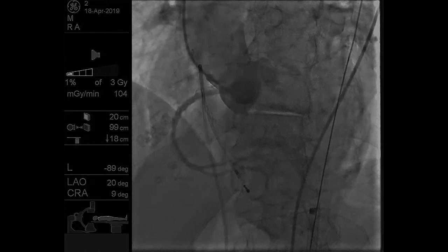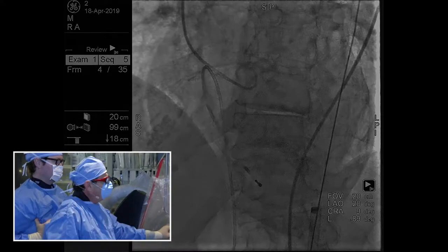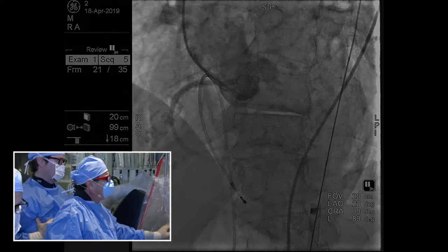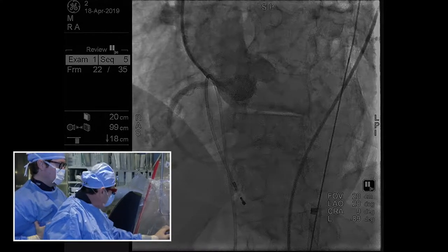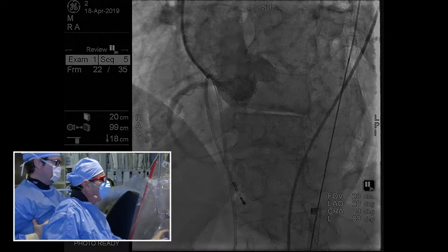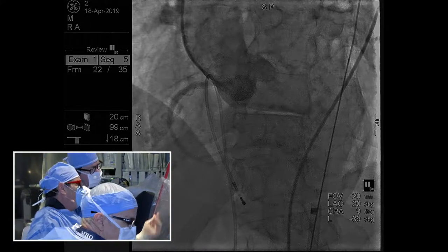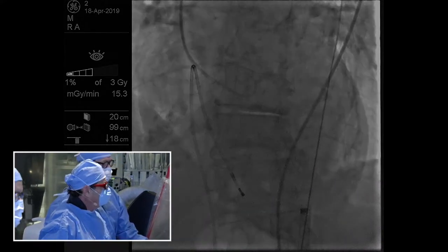Okay. And now we've got a nice cusp view. Now we've got three little scallops there, right? So those are the sinuses. And you can see the coronaries coming out there as well, which are important. You could argue that you could go a little more AP here too, but I think we're probably good enough. All right, that's good.